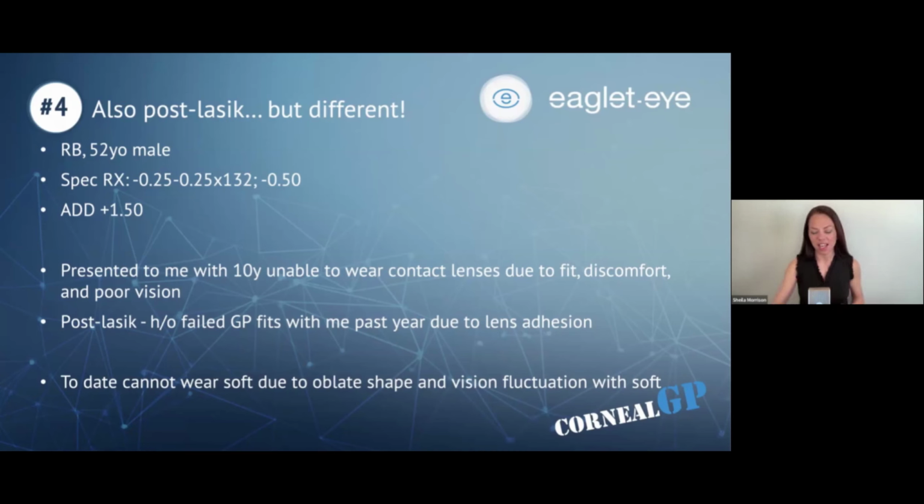So he presented thinking that he would try something new. He had done a lot of research and was aware of some of the mapping technology that we had at our office, and came to me and asked if he could be measured with the technology so that we could try to design something new that he hadn't tried before.